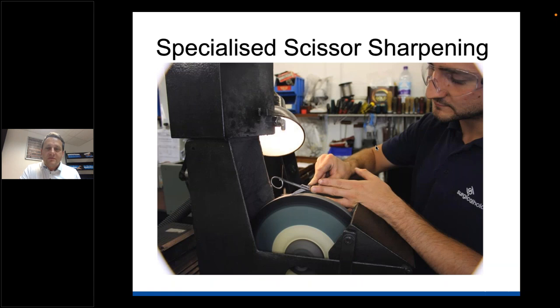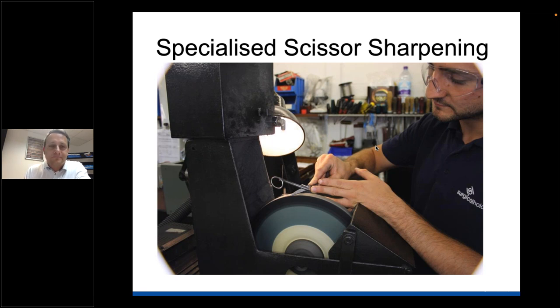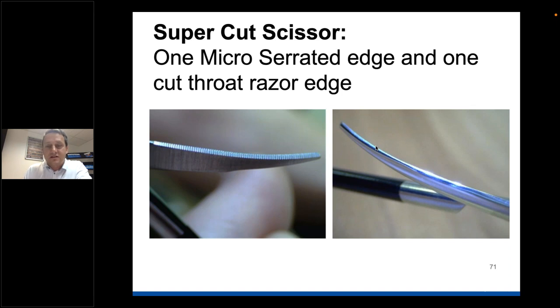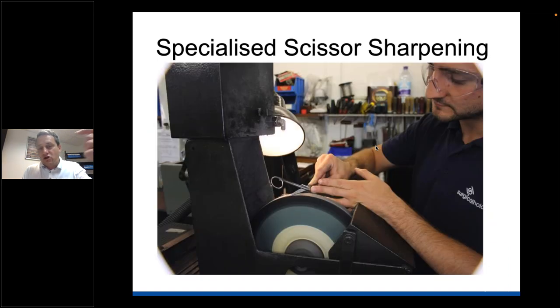We have many different specialized sharpening wheels for surgical instruments - this one is specifically for scissors. For supercut scissors, there is a specific grinding wheel because they have a particular edge. A supercut scissor has one serrated edge and one ultra-sharp razor edge - the serrated edge grips the tissue while the sharp edge cuts it. To maintain that, you need particular wheels to sharpen them on.